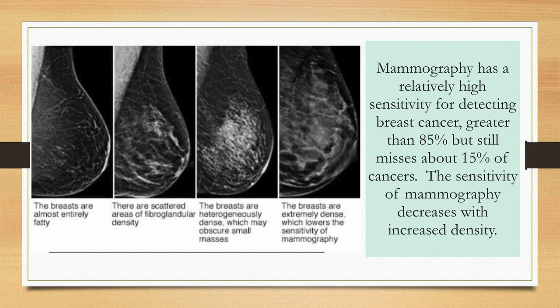So just to give you a visual, so when you hear the density, this is a patient's left breast. These are all different patients' left breasts. So the black on the mammogram is fat. The white on a mammogram is the fibroglandular tissue of the breast. So this patient has very dense breasts, very little fat. This patient has mostly fat.